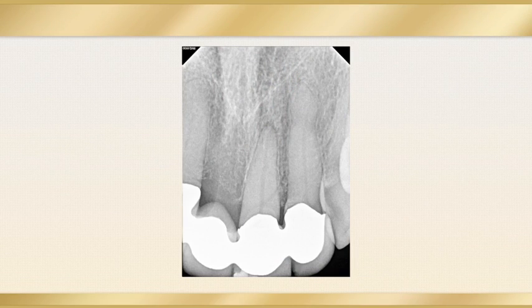Here's another case. This is tooth number 9 again. I think all of you can treat this case. What makes this a little more difficult is there's a bridge on it. So you have to know how to access through a bridge, and you have to be confident that you can get into that pulp chamber. And I'm going to discuss accessing through a crown a little bit later.